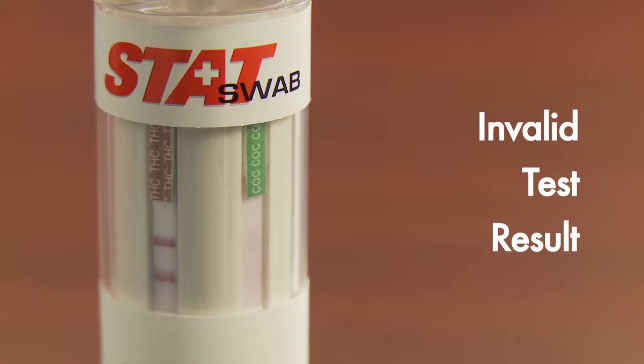If the control line fails to appear, the test should be regarded as invalid. This is usually due to an insufficient amount of oral fluid being collected. If the line fails to appear in only one test strip, try tilting the testing device slightly toward the invalid strip and tapping the bottom of the device lightly on the table to facilitate the flow of saliva to the area. This should help break up any air bubbles that formed in the saliva.